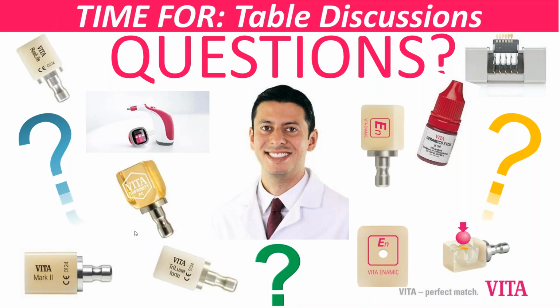I invest time doing my putty matrix, relining it, and then cutting it in a way that as soon as I put it in the patient's mouth, the same matrix cuts the excess, and then with the explorer, very gently, I can remove that excess.